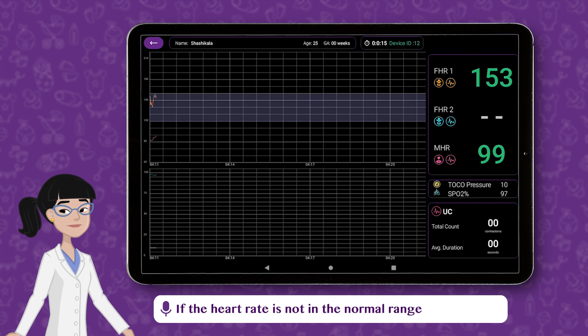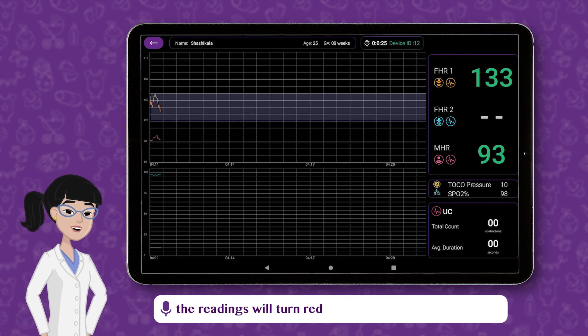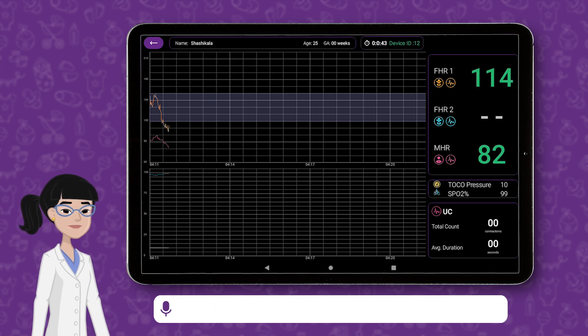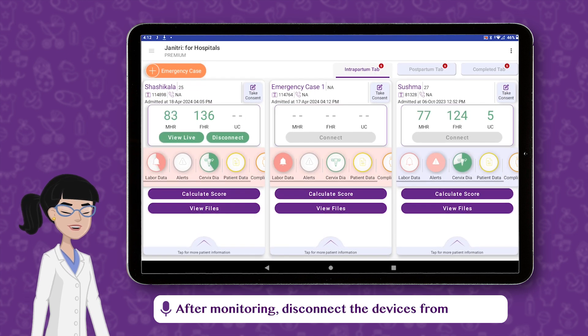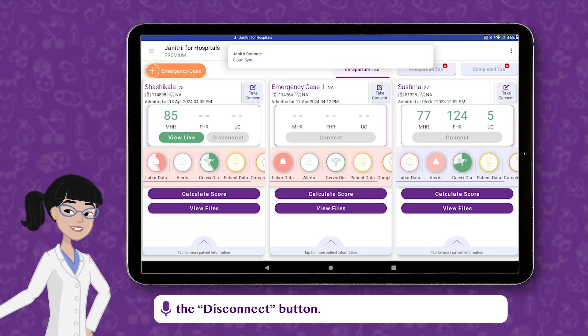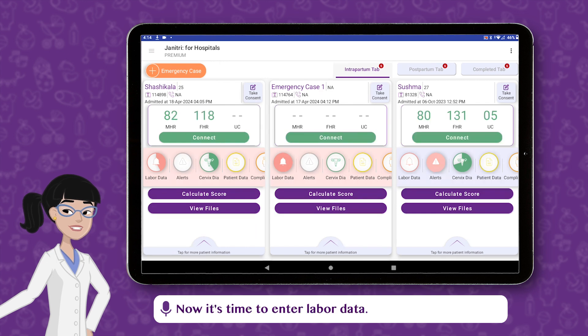If the heart rate is not in the normal range, the readings will turn red and you will hear the alert sounds. After monitoring, disconnect the devices from the Disconnect button.